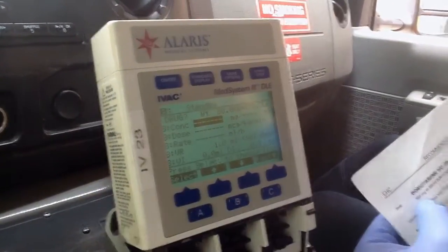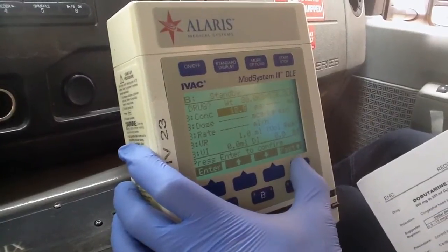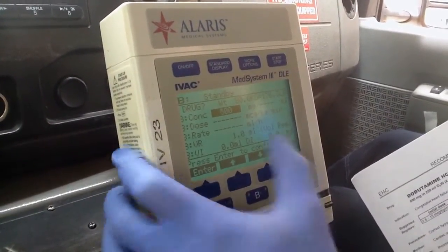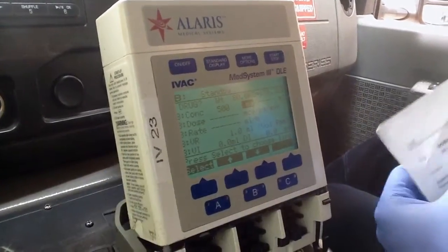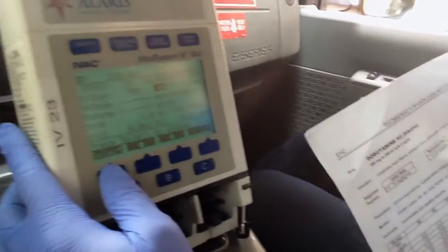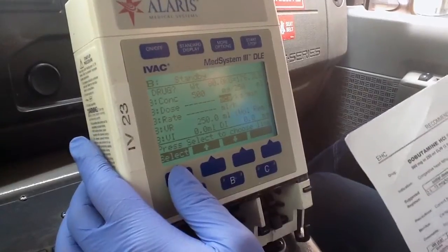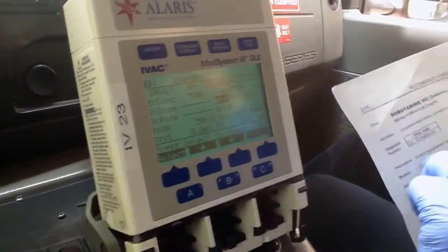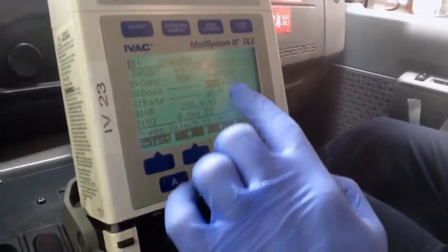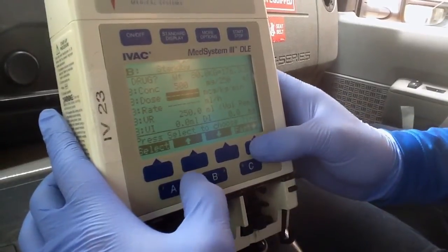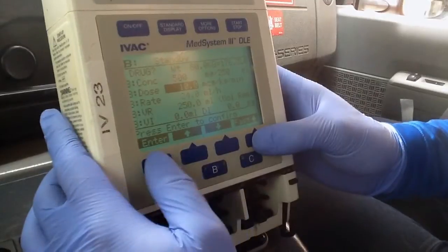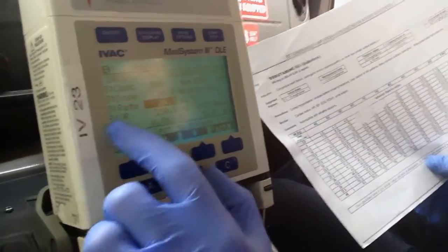For concentration, it's 500 milligrams in 250 mL of D5W — fast up to 500, enter. Make sure you always double-check the units: milligrams, confirmed. Volume is 250 mL, enter. For the dosage, the range is 2.5 to 15 — we'll use 10 micrograms per kilogram per minute. Confirm micrograms per kilogram per minute, enter 10, and press enter. The pump calculates 24 mLs per hour. Double-checking: at 10 micrograms per kilogram per minute for an 80 kg patient — the answer is 24 mLs per hour. The pump is correct.